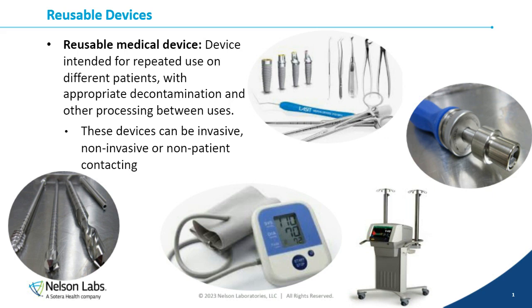Additionally, it's worth noting that reusable medical devices for single patient use are also under this definition. Devices such as menstrual cups or CPAP masks are considered reusable medical devices, even though they are for single patient use only. So a lot of what we will talk about today will apply to devices for multiple patients, but also those for single patient use.